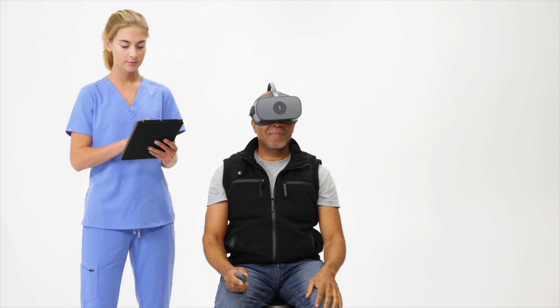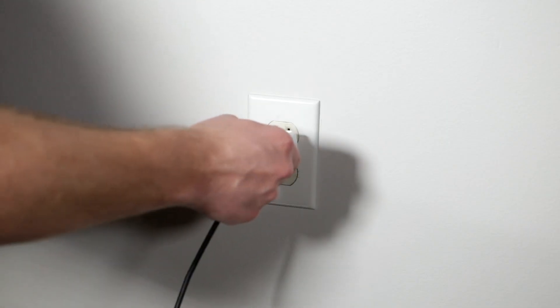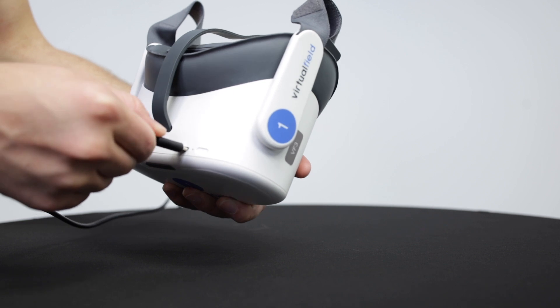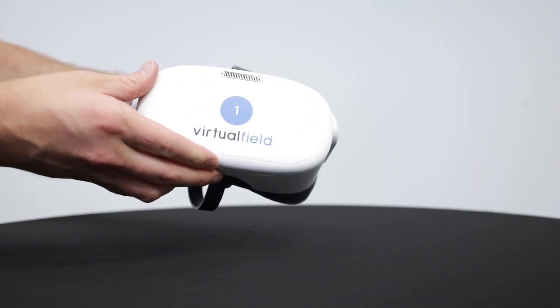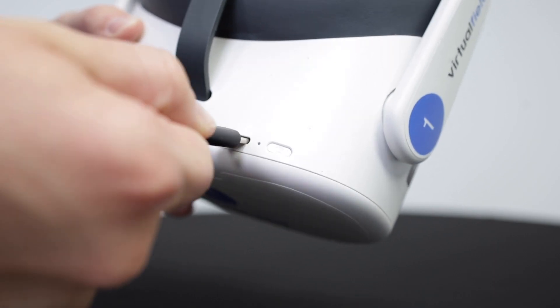With Virtual Field, you can test wirelessly from any room in your office. In order to do this, it's important that you have a protocol in place to keep the device charged. First, make sure your charger is plugged into a wall outlet and not a computer or laptop. Push the charger into the headset until you hear an audible click. If you have the black device, the charging port will be on the bottom; if you have the white device, it will be at the top.